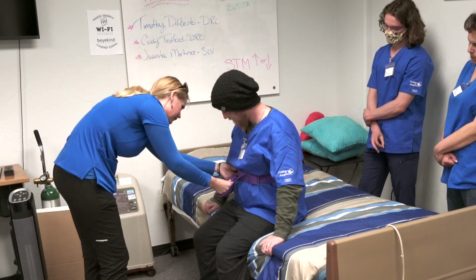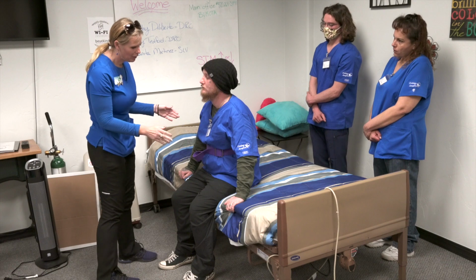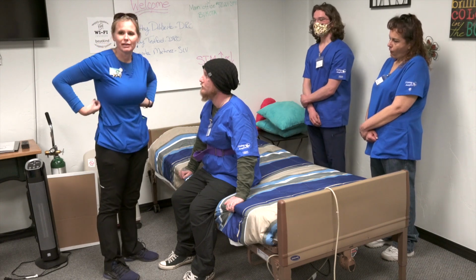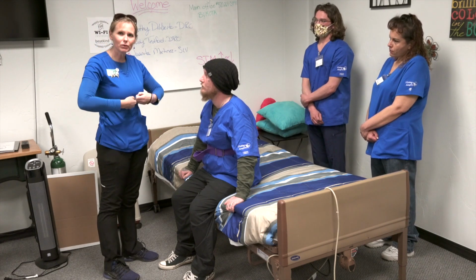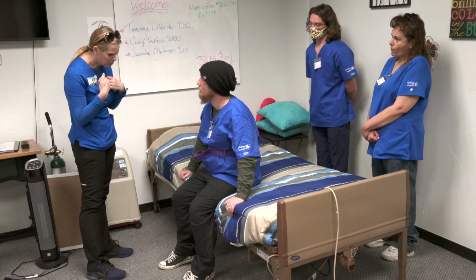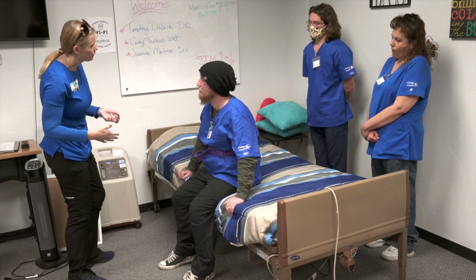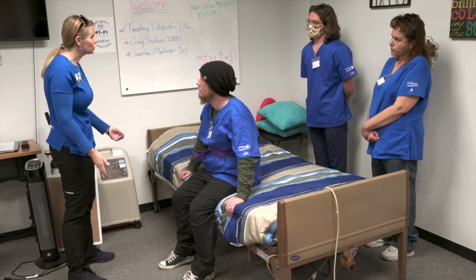And then we're just going to tuck this in and get it out of the way. Now when we're working with the gait belt, we either want to grasp onto the sides or the back. We don't want to be manipulating it in the front. So Cody, your legs are important, but mine are a little bit more important since I'm the one doing the transfer. I'm gonna again want my legs about shoulder width apart.